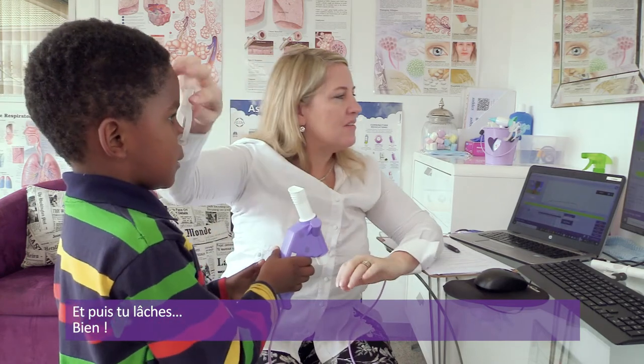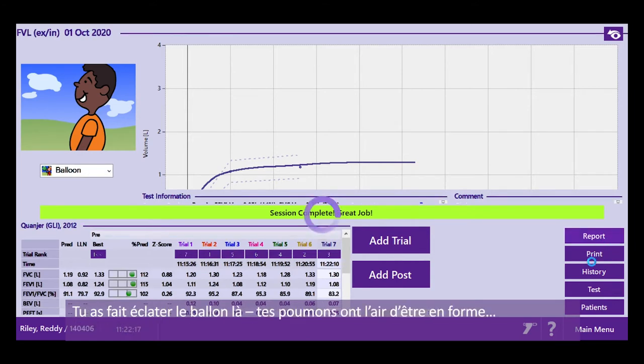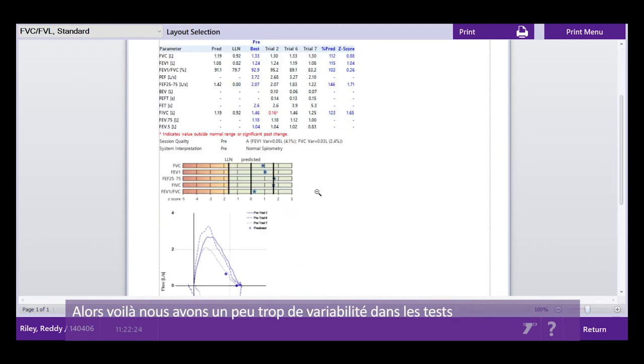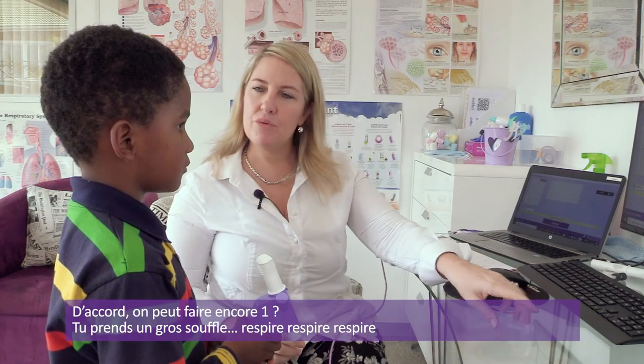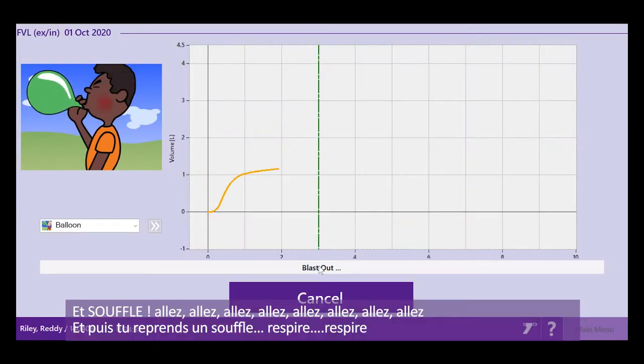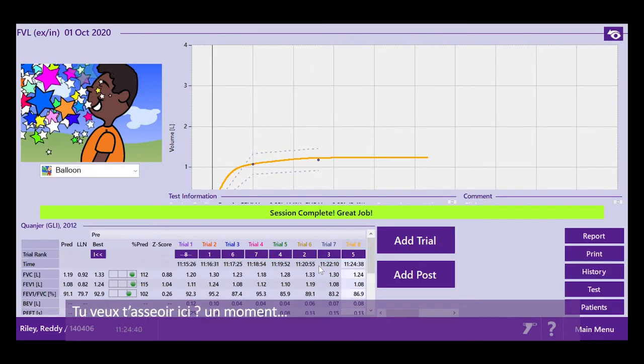Okay, good. Yep, that one wasn't bad at all. All right, so let me see what we've got. You burst the balloon there. Your lungs are looking good. Okay, so you see we've got a little bit too much variability in our tests. All right, are you ready to do one more? Okay, take a deep breath in, into your mouth, and breathe in fast. And rest. Well done. Good boy.